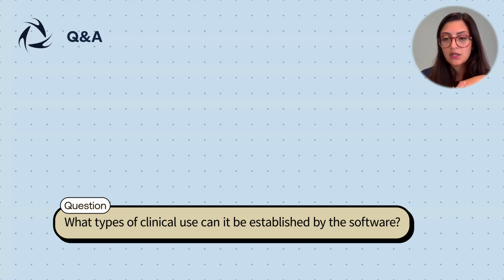It's especially used for the range of motion and joint mobility, to evaluate the mobility of the joints. And there's also the possibility to obtain at the same time the muscular activation inside the movement, so that could be useful in that case. And it is very much used to evaluate gait. A lot of physiotherapists use it for gait analysis. It can be used for elderly people or even children. So it is very versatile as a system, both of them actually.